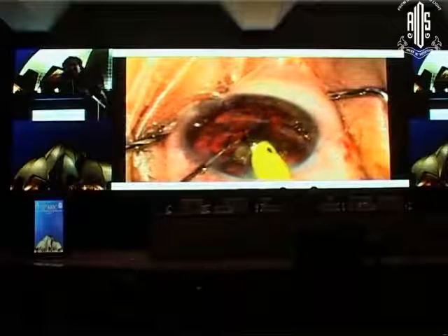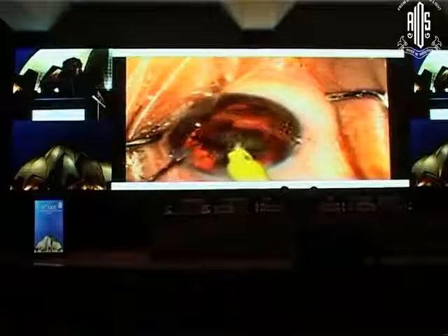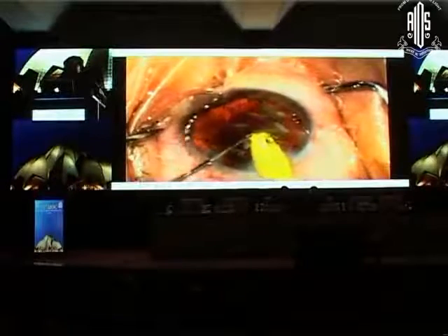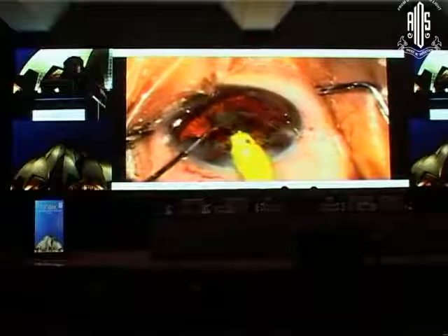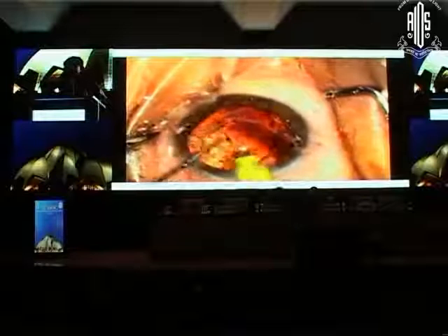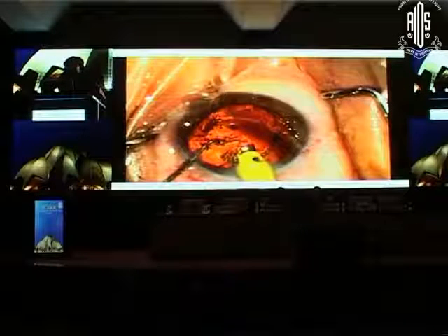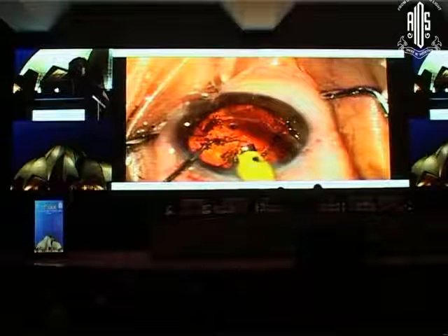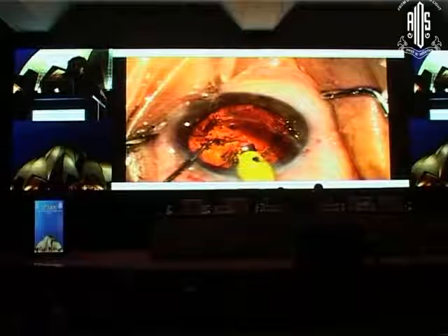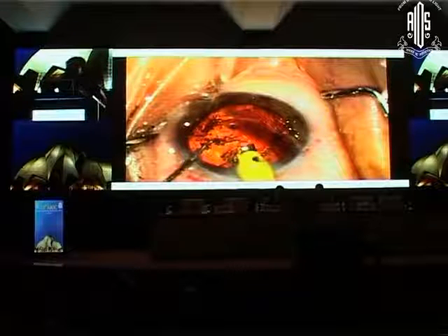So this is the basis of phacoemulsification, and we are using all the techniques which have been described by Lahane sir. As you saw, all the words that we use, the followability, the nucleus pieces which are sucked into the phaco tip is the followability, and the rest is chopping and cutting. So you know that this was the second technique, or the straight Nagahara's chop, which is used to emulsify the nucleus. And in this technique, the amount of phaco power used to trench the nucleus is less.